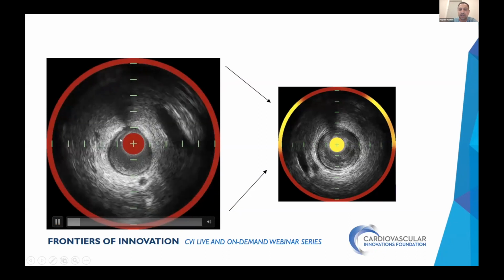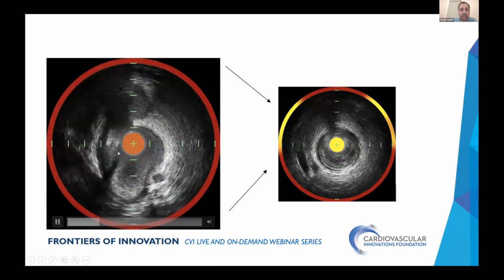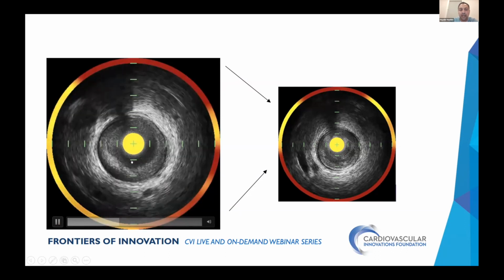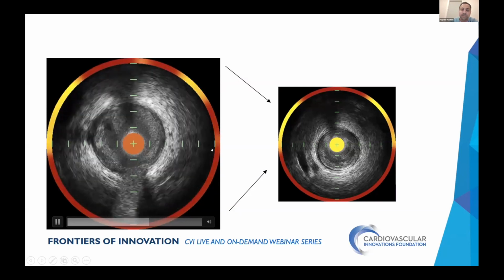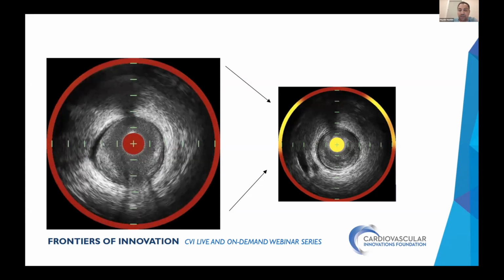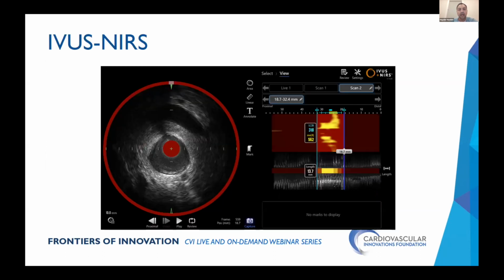Distally, you see very good distinctive layers of intima and media. But as you approach here, you definitely see very thick plaque. It has this vacuole appearance to it, quite lipidic based on the color code. So I knew that this 50-60% angiographically and physiologically, now it's even more vulnerable with lipids.